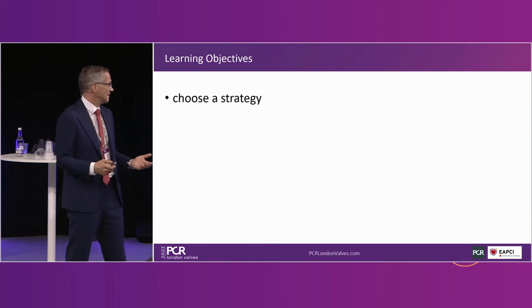Well, the surgeons didn't want to go for another surgical case, so surgical strategy. So we said we go for TAVI.